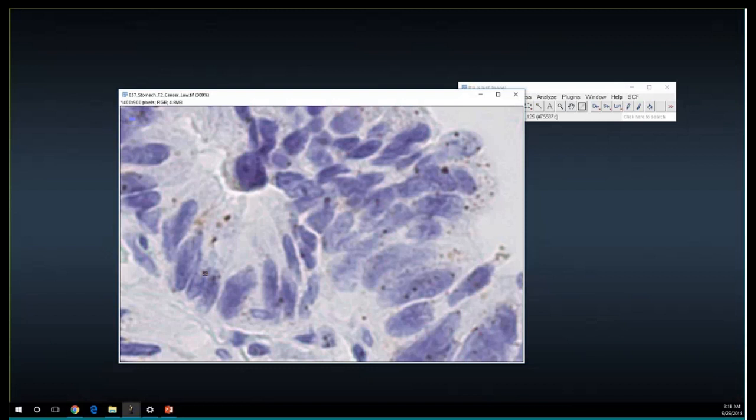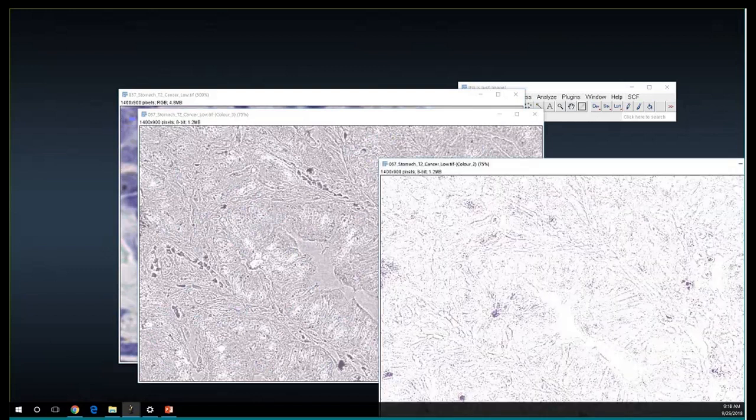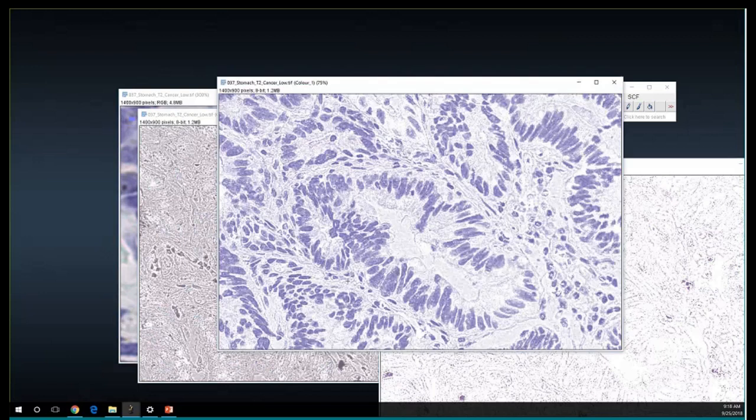Let me say I selected this to be my second color, and this here to be my third color. And let's look at the results. Still, the deconvolution is going to work, but now if you look closely at these nuclei, you can see you get more noise, you get more holes in the nuclei, and we get all these artifacts due to this selection. So at the end, it's an optimization process.